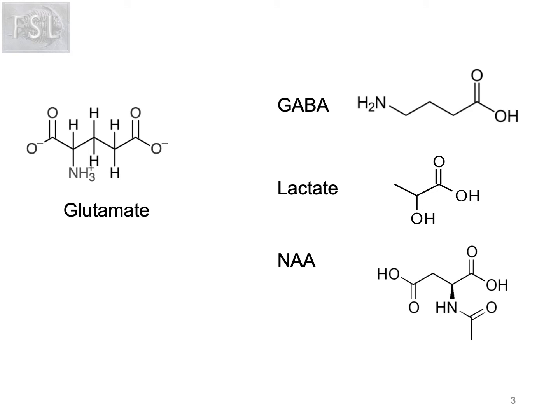But we know the brain contains many other chemicals of interest: neurotransmitters, energy substrates, and many metabolically active substances. Here we see just a few, and hopefully you will notice that they A. have different chemical structures, and B. because of that have many differently arranged hydrogen atoms. You can see a few of those protons here on glutamate.